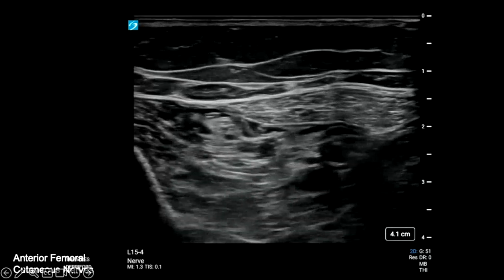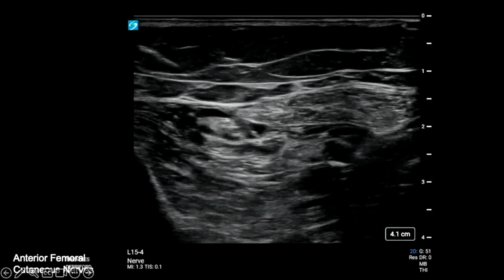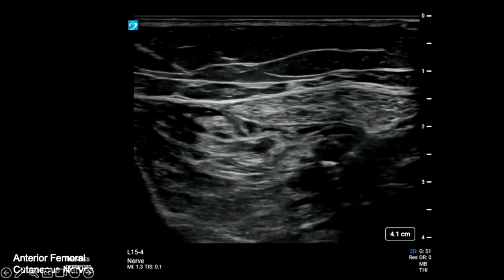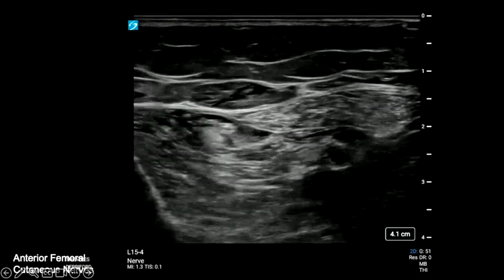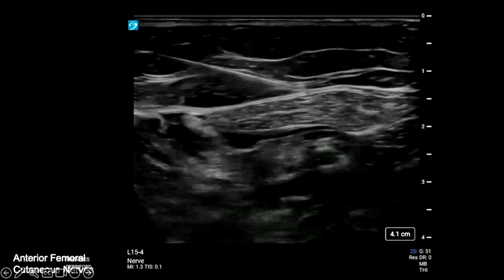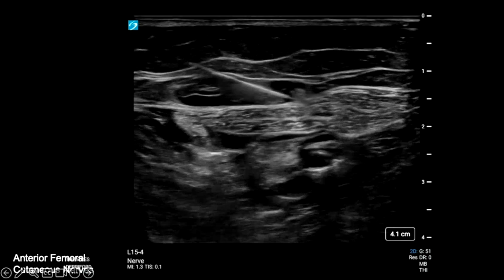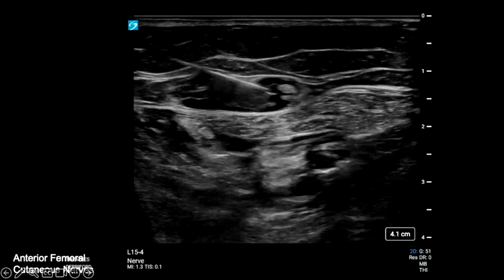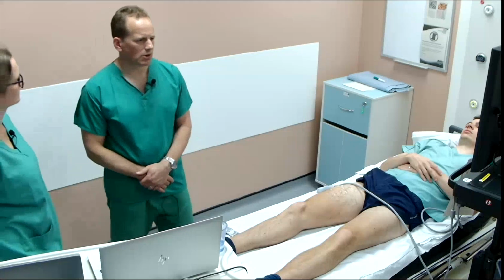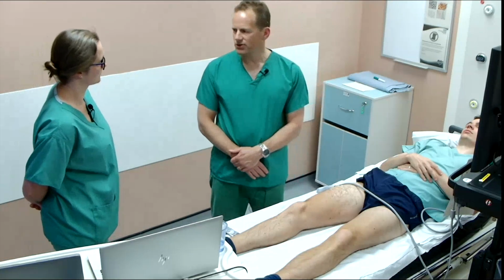And then again, there's some little white hyperechoicities in the center of the screen. So I've taken a separate needle puncture to reach these. So again, just a couple of mils around each of these, and then just moving along a couple of mils along each. So depends on how many targets you've got, but typically I would end up using maybe a total of about 6 to 10 mils to get all of that.